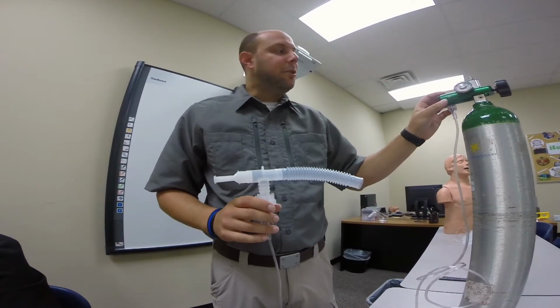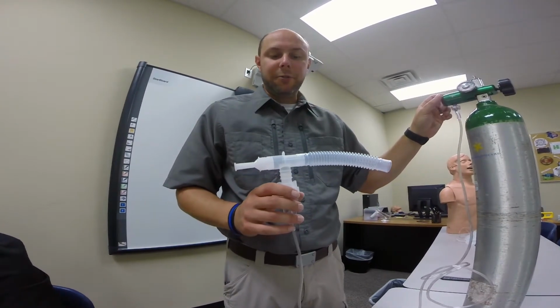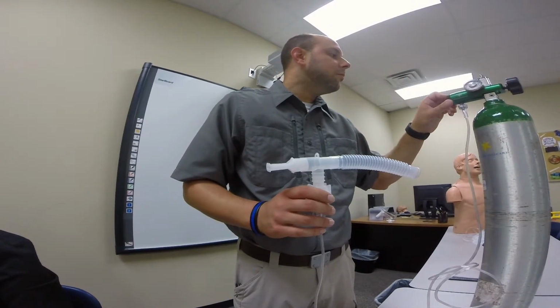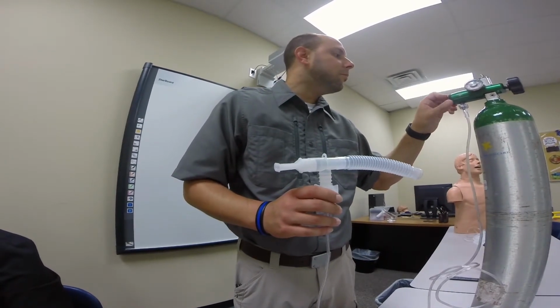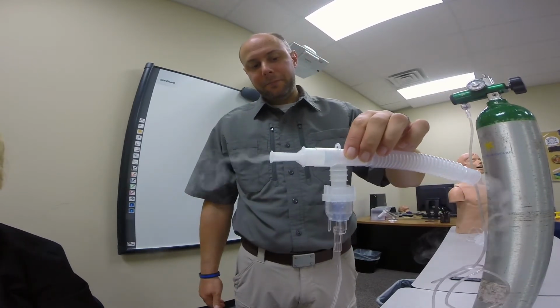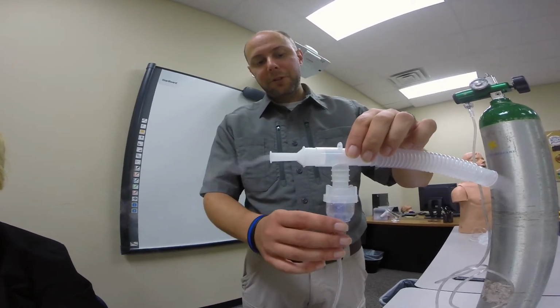Now when you're flowing a neb, you want to flow it between 6 and 8 liters per minute. So we're going to set it at 8. And you can start to see it vaporize. So now we'll administer it to the patient.